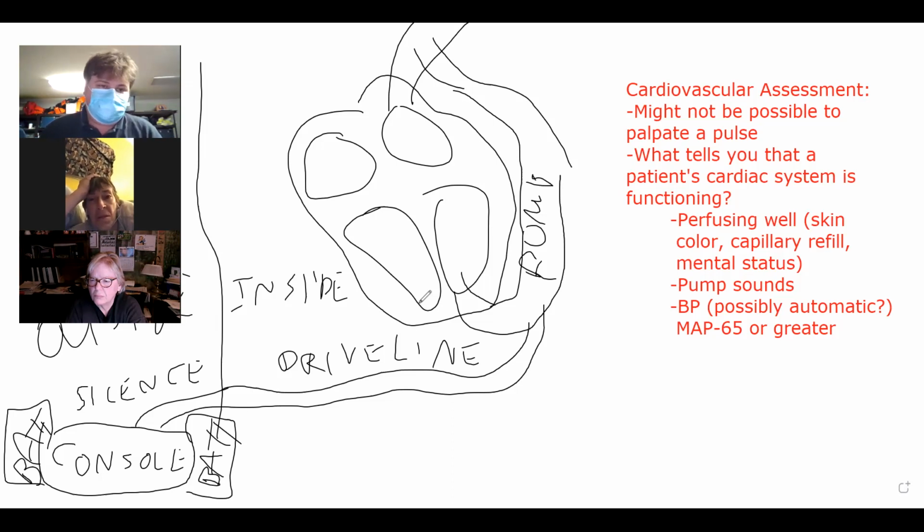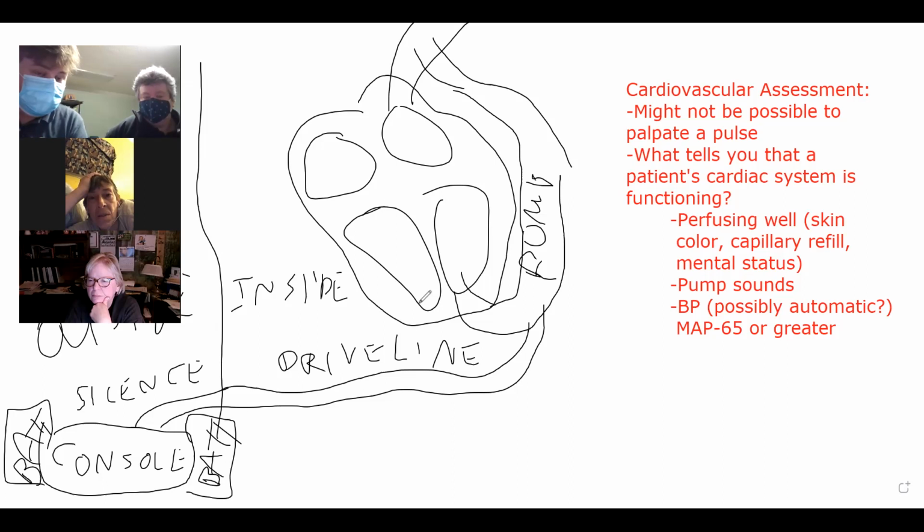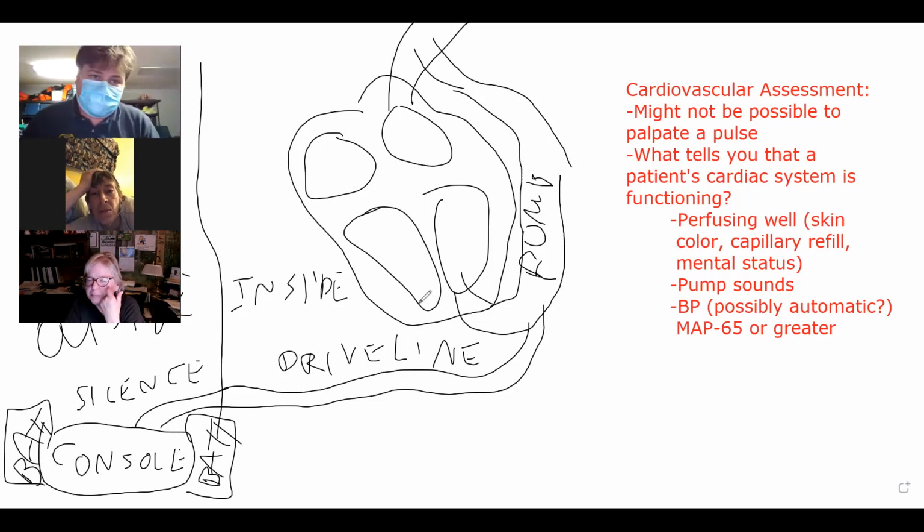I know there were a couple in Morrisville when we first did LVAD training, and that's the reason we did the LVAD training, because there were 2 patients in Morrisville that had them. So they just had the feeling that there'd be more exposure to them. But I'm assuming anyone that has one of those devices would at least inform the hospital, but whether that's also communicated to the EMS squads, probably not.